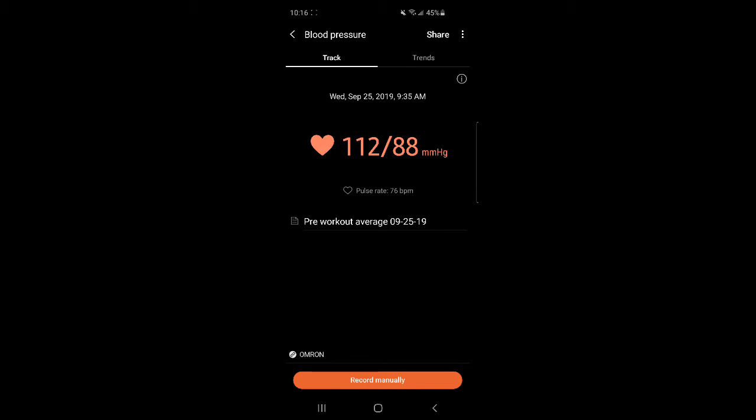They say to take your blood pressure on your non-dominant arm. So I'm right-handed, and they say to take it on your left. I haven't eaten anything, haven't had any caffeine, haven't really been exercising, quote unquote, although I should. But I haven't been doing any vigorous activity. I did drive up the street and take out the trash, but now I've been settled in for a couple minutes, and I think that's good enough to get the heart rate back down and hopefully give an accurate reading.